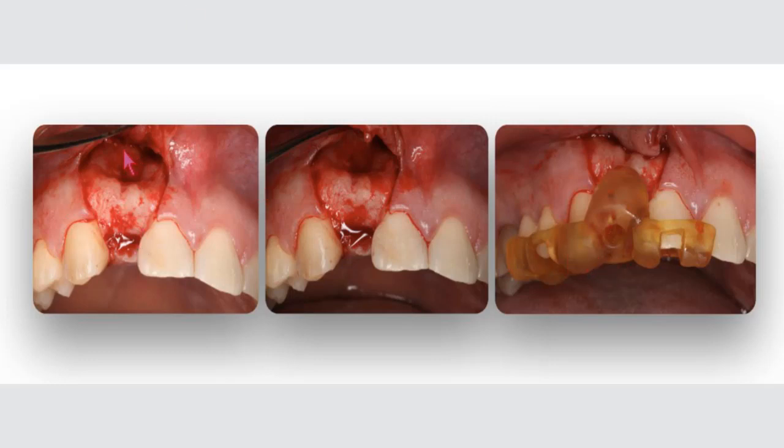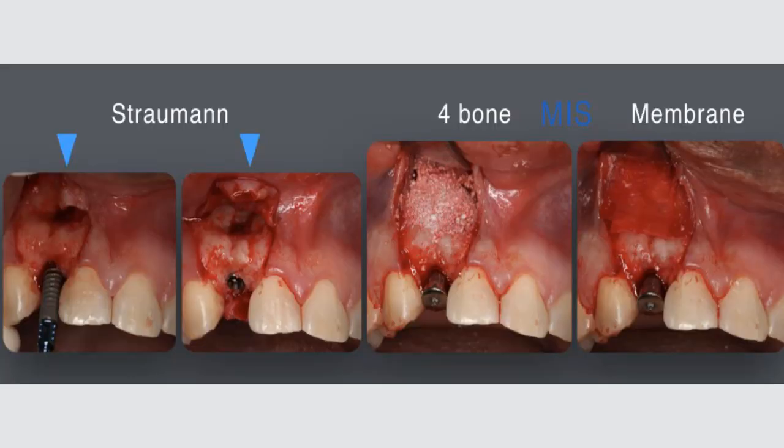guide is in place. Surgery was open, guide in place. As you can see here, the fenestration happened. Maybe the slides here need to be moved differently. But as the guide is placed, you go for the implant placement.